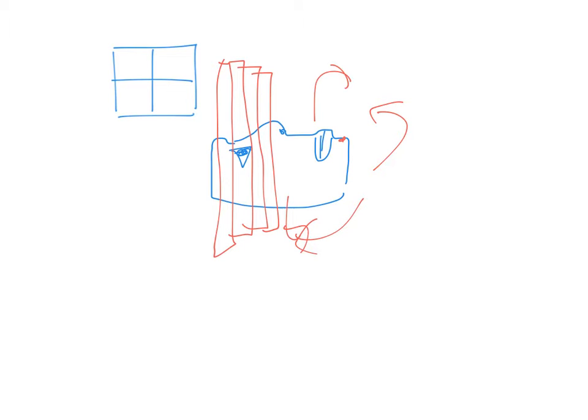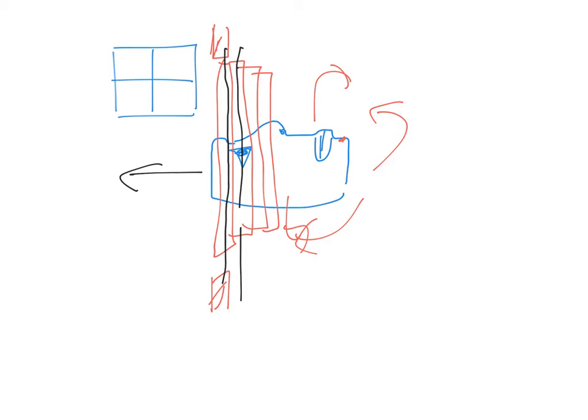Alright? Okay, so why do you do slice by slice? Because your X-ray detector and your X-ray tube are on opposite sides. So what will happen is the X-rays will be sent through that slice and come out, and then it will detect what is inside that slice. Then your body goes in, then you take the next slice. So you send again, and then it comes out on the other side. Then you see what is the image of that slice. So what I'm going to show you is how to get the image of one slice.